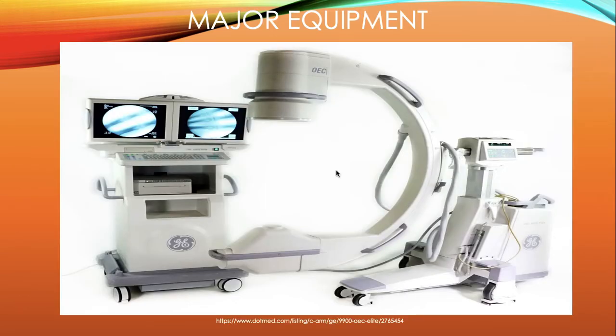So, major equipment. Here on this slide I have an image of a C-arm, and you can see the monitor as well. This is basically how the X-ray tech is going to be able to take the image, and the image will show up right after.